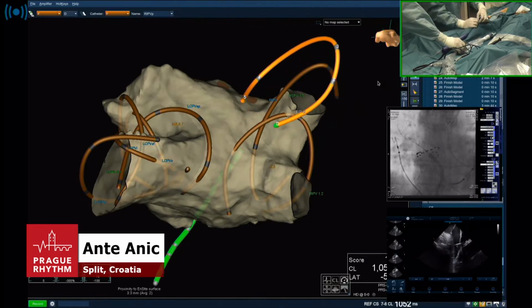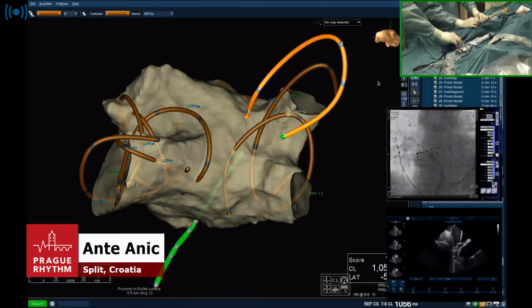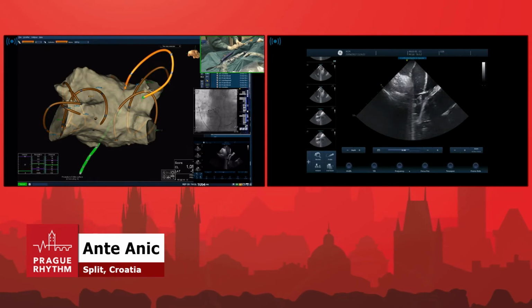Okay, first we're going to apply segmentally. So we're going to apply. You see that we have good contact covering the upper part. Yep. So let's do the segmental part because it's a big vein. It's going to jump in. So let's go here. We go for the right superior PV, pulse 1.